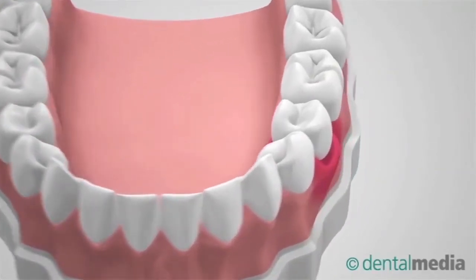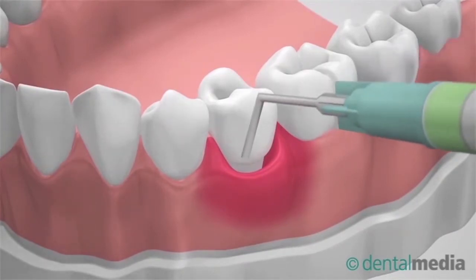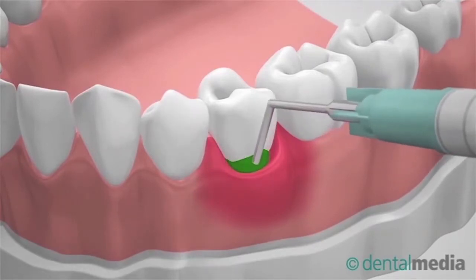Immundo Treatment Procedure. First step: apply the green liquid Immundo into the periodontal pockets, which will also mark the infected tissue and bacteria.